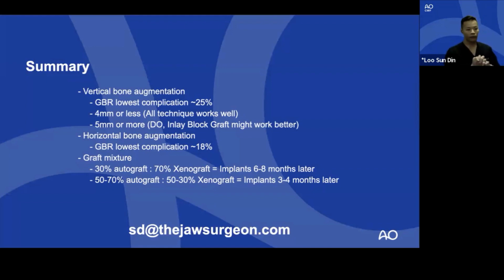As for how much bone I can get, it really depends on anatomy. Sometimes it's roughly 2 millimeters thick in the maxillary palatal region, and I have to go to the mid segment where there's an alveolar maxillary crest to get more bone. I would not hesitate to go all the way through, even though the bone collector might touch the nasal mucosa, because I'm not going to damage it.